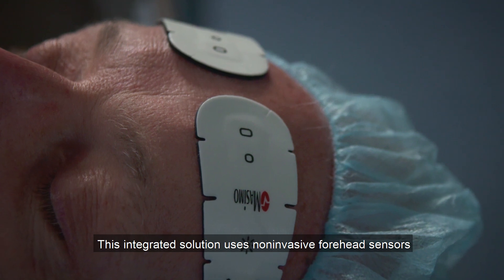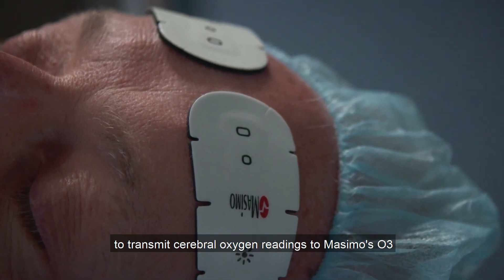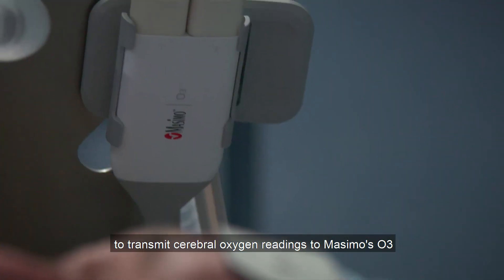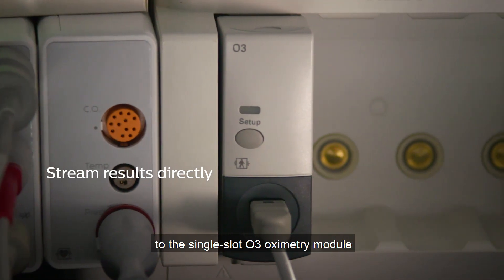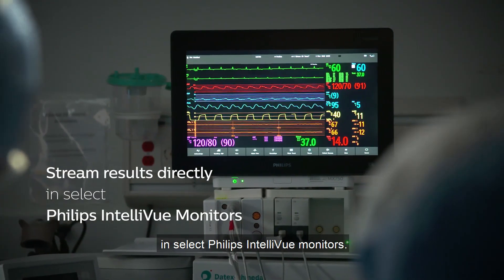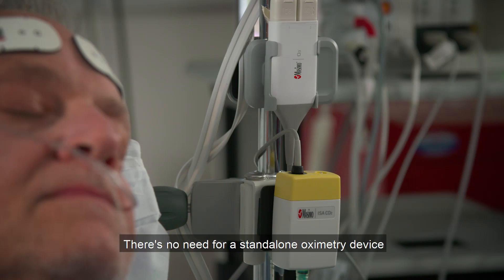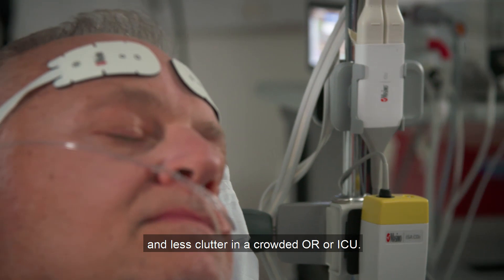This integrated solution uses non-invasive forehead sensors to transmit cerebral oxygen readings to Massimo's O3 measurement device and stream the results directly to the single-slot O3 oximetry module in select Philips Intelliview monitors. There's no need for a standalone oximetry device and less clutter in a crowded OR or ICU.